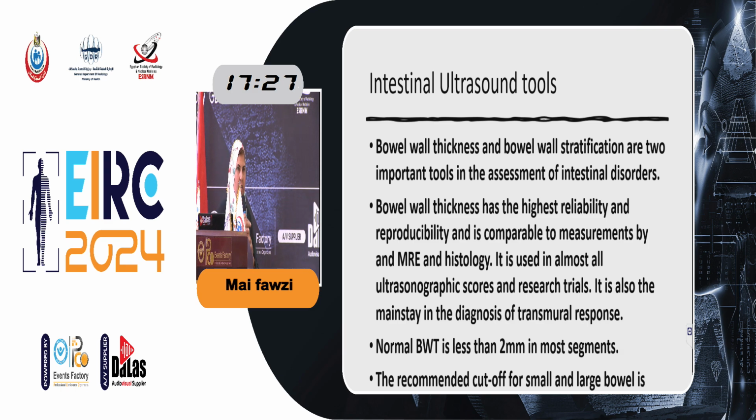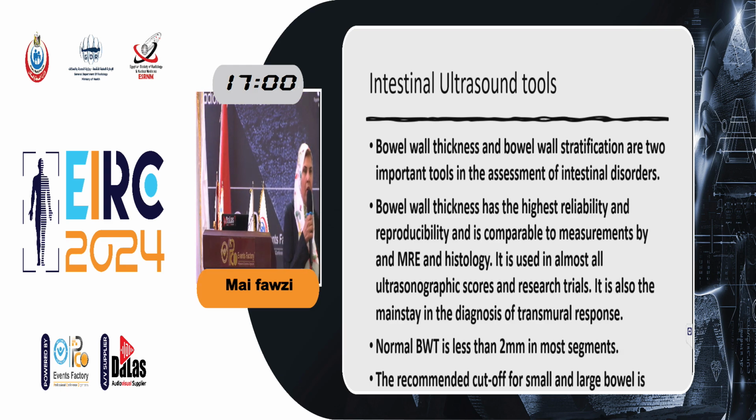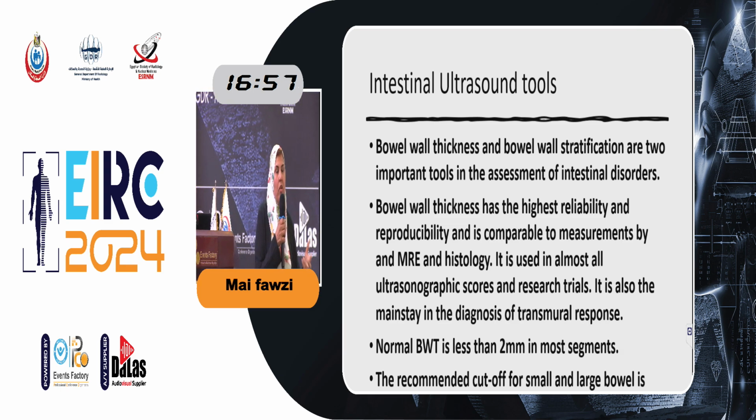The most important tool in bowel ultrasound is bowel wall thickness, where diseased bowel is thick. I have to remember that diseased bowel and its thickness differs from one segment to the other. But when examined between radiologists, bowel wall thickness was the most reproducible of all the bowel findings. They differed on stratification, whether uncertain or absent. They were not equal on vascularization, but the bowel wall thickness was the single most reproducible, intra-observer and inter-observer.